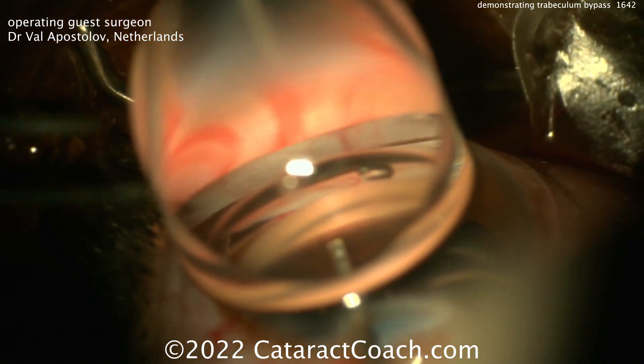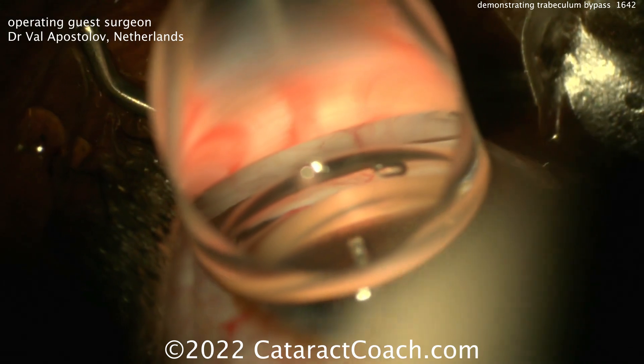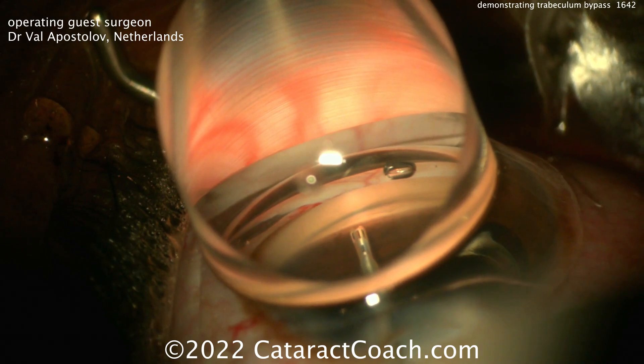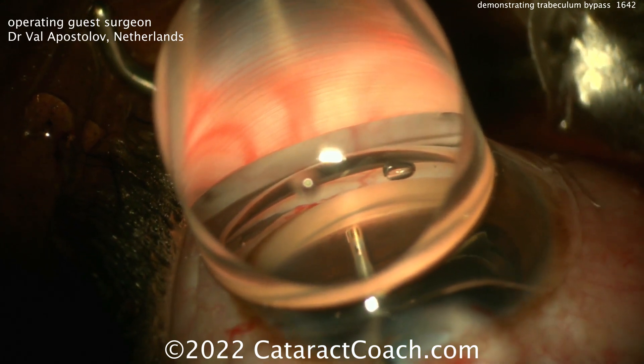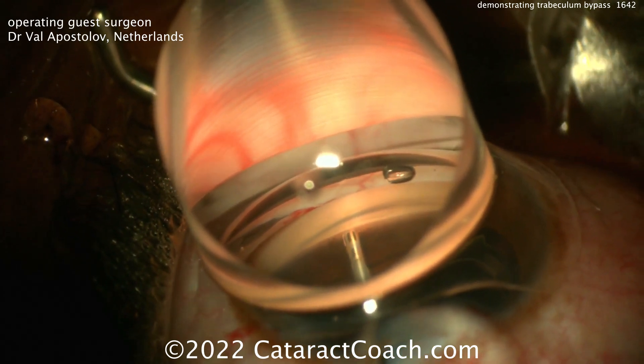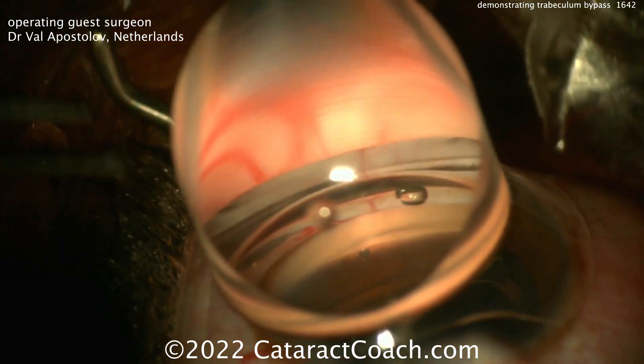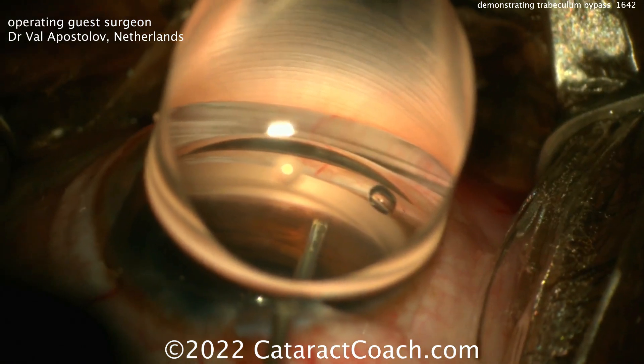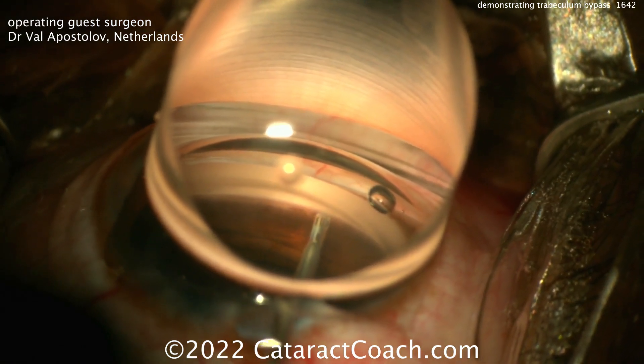We've featured many of these MIGs surgeries before. They're effective, but to a degree. On the spectrum of glaucoma procedures, you have many different options, and it's up to the surgeon to decide what's best for the patient. So in a case of very severe glaucoma, maybe this isn't the best option, but for more mild to moderate cases, this could be very good.